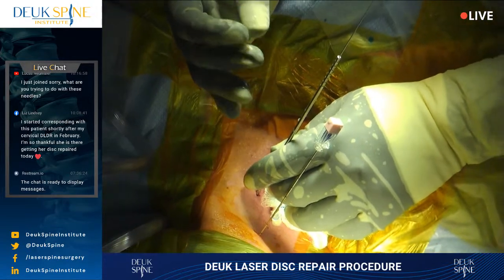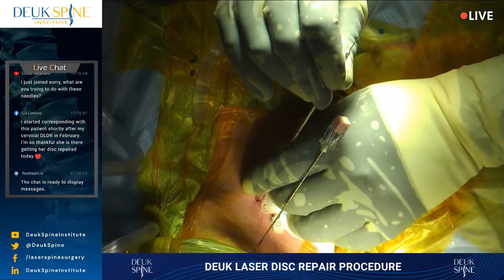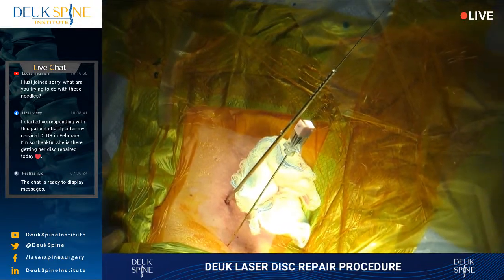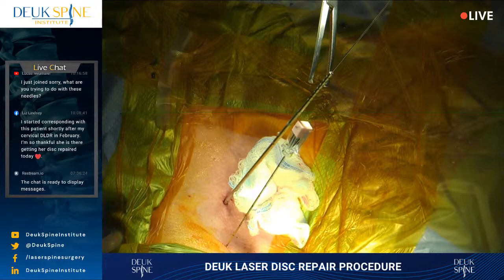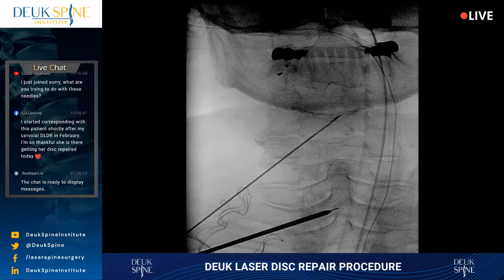And the reason is that there's a paucity of training. There's nowhere to go to get trained, and there's equipment that's very expensive to buy, and it's not available in most hospitals. Let's get an AP. So it's a training issue, it's an equipment issue, and to be honest with you, it's a hard surgery to do. So there's what's called the steep learning curve. It's not easy. Shot.